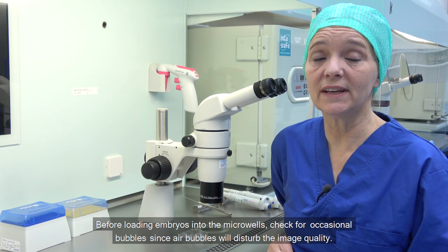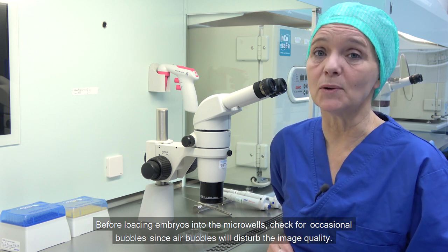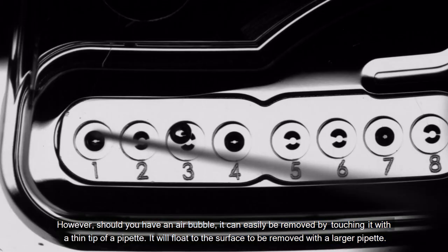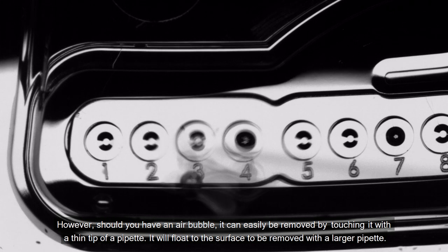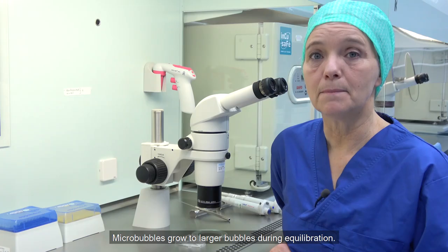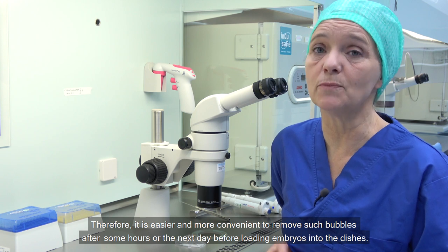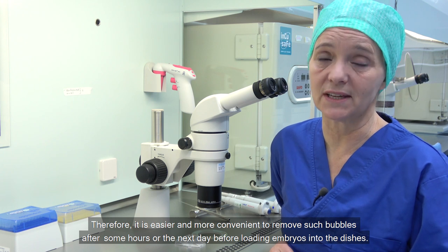Before loading embryos into the micro wells, check for occasional bubbles, since air bubbles will disturb image quality. Should you have an air bubble, it can easily be removed by touching it with a thin tip of a pipette, and it will float to the surface to be removed with a larger pipette. Micro bubbles grow to larger bubbles during equilibration, and therefore it is easier and more convenient to remove such bubbles after some hours or the next day before loading embryos into the dishes.